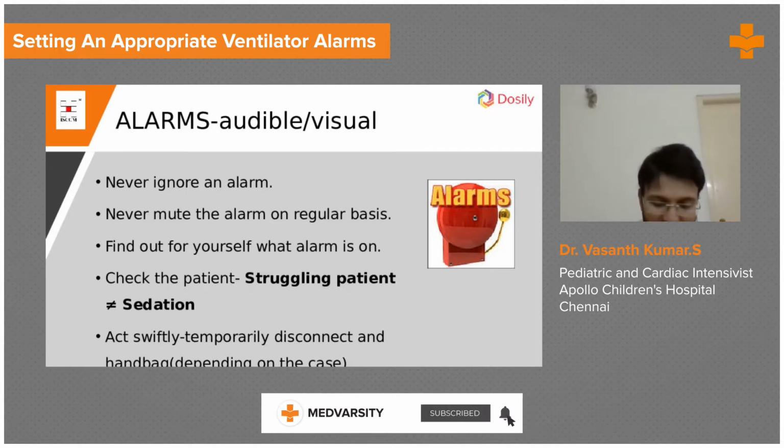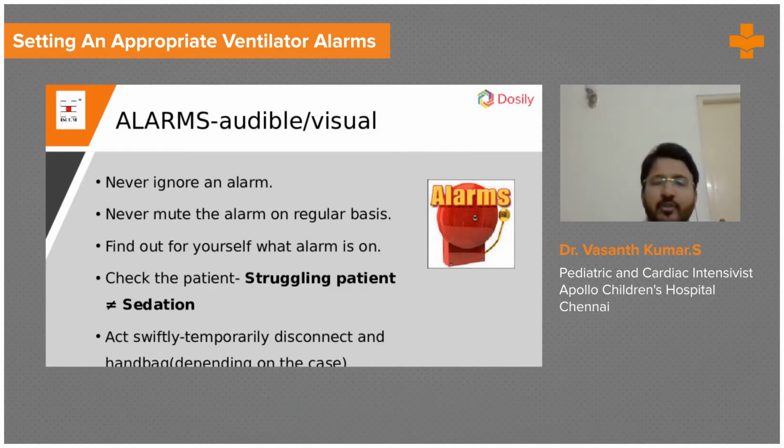Once you identify the problem, only then will you be able to find a solution, and each time you try to troubleshoot it, you will be a better ventilating person. So always check the patient. Suppose you find the patient is struggling while on the ventilator.